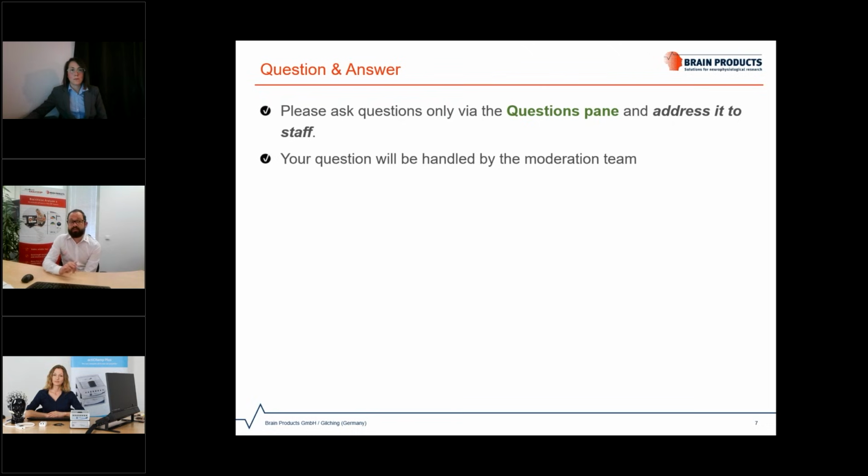So if I use these blink markers from the eye tracker and tell the algorithm where the blinks are, then it can make use of these markers to check in the ICA which component is related to these blinks. So I could definitely make use of it for eye blink removal.